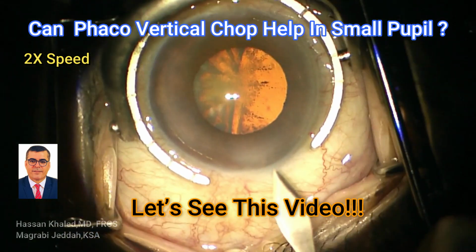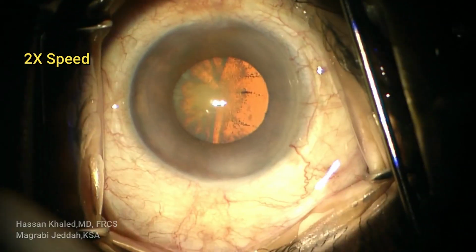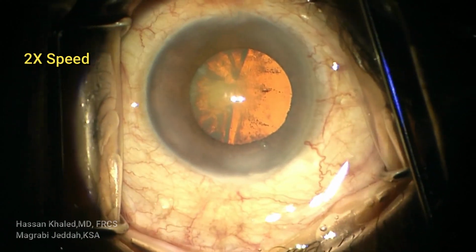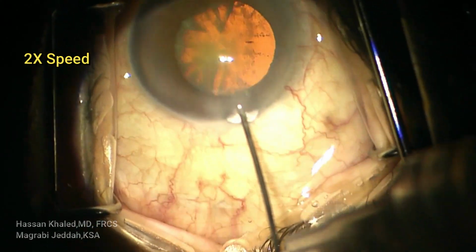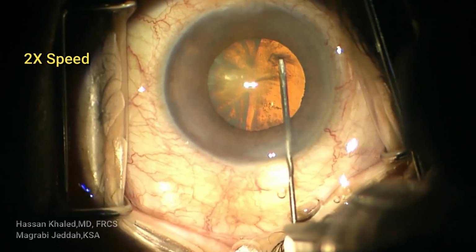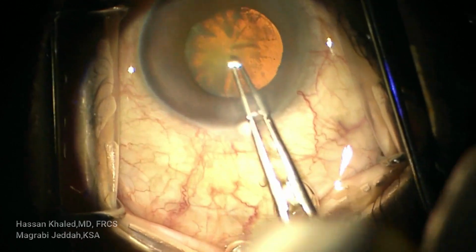Why is a small pupil a risk factor for phacoemulsification, and can the vertical chop technique help cataract removal in a small to moderately dilated pupil? Let's see this case of phacoemulsification in a moderately dilated pupil. In this case, the pupil diameter is about 4 millimeters.